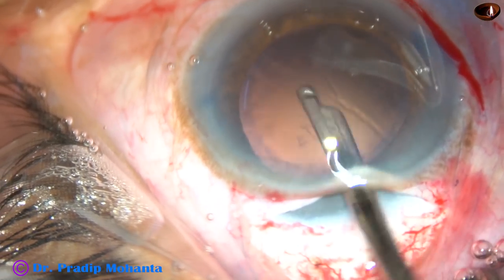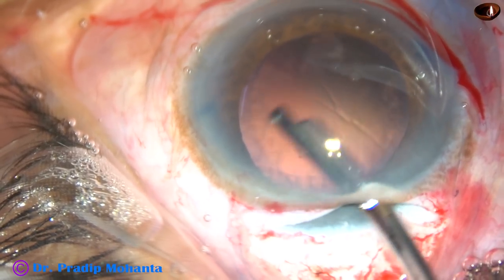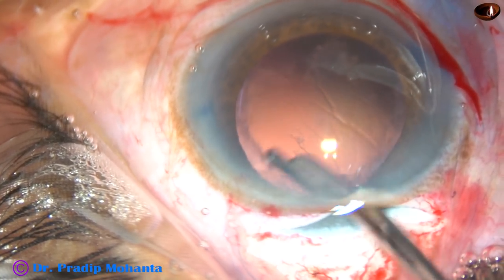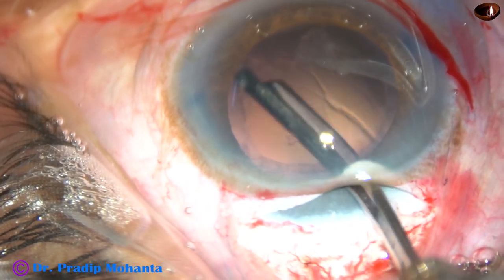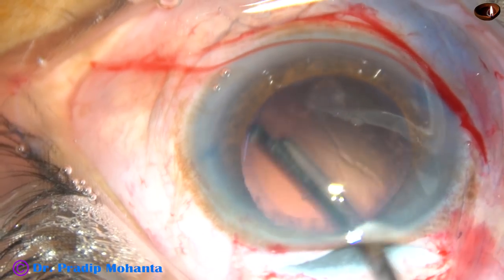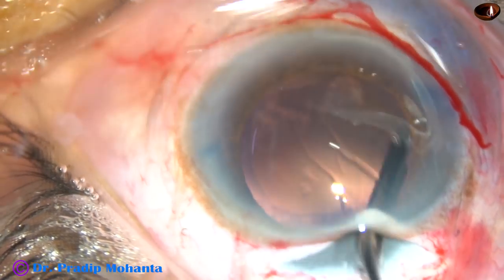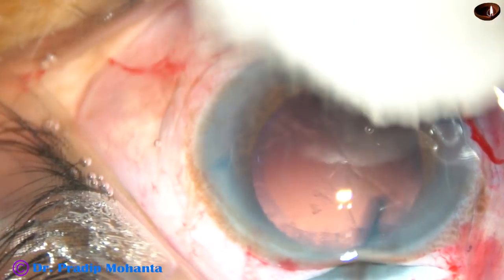Now cortical cleanup is being done with the help of a Simcoe cannula. A lot of cortical matter is sticking to the posterior capsule.